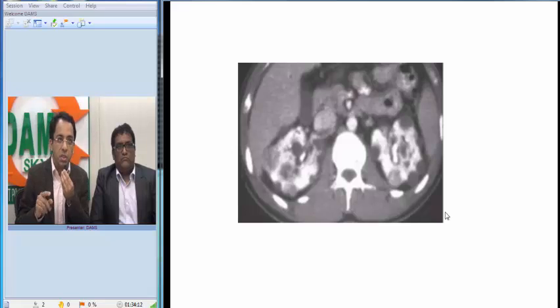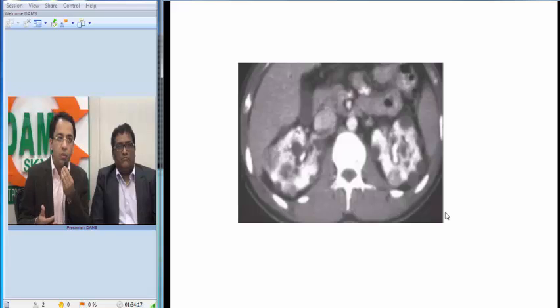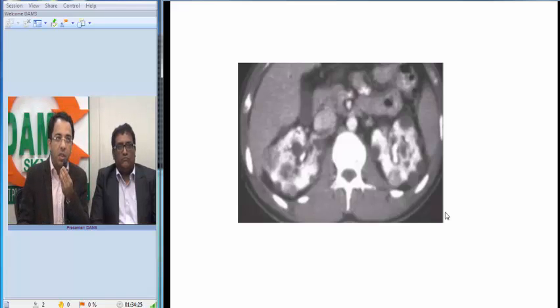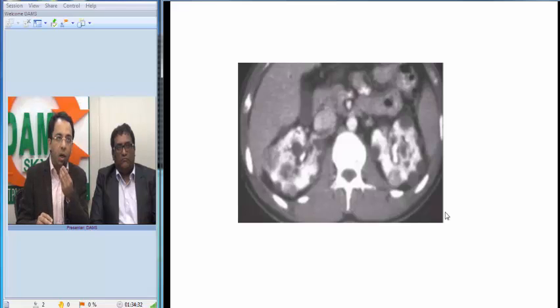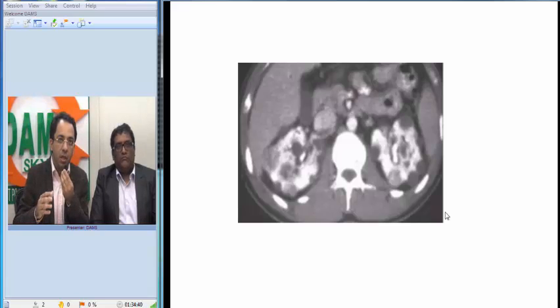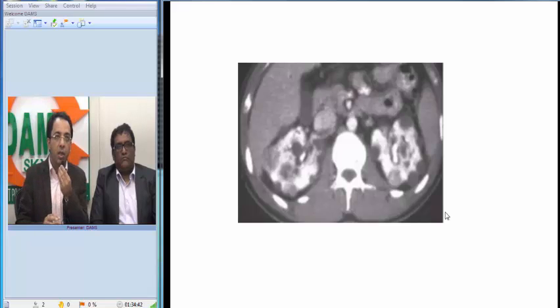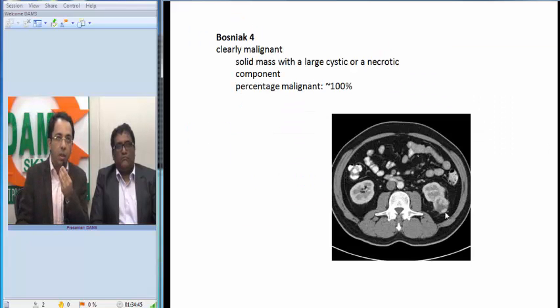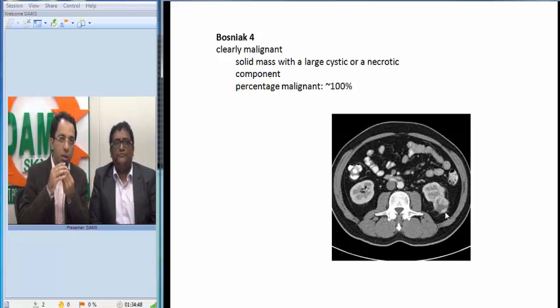There is a mixture of cystic disease with malignant lesions. When we have multiple cysts in both kidneys, normal intervening renal parenchyma, and some neoplasms, one differential that comes to mind is VHL — Von Hippel-Lindau disease — with its association with cystic disease and RCCs. Another differential would be tuberous sclerosis complex, though I keep it lower down because I do not see any fat attenuation in any of the renal lesions. I will now invite Dr. Sanjeev to give his comments.